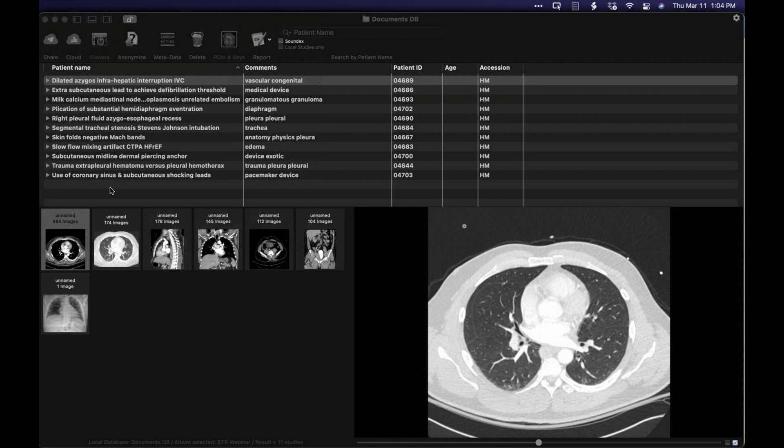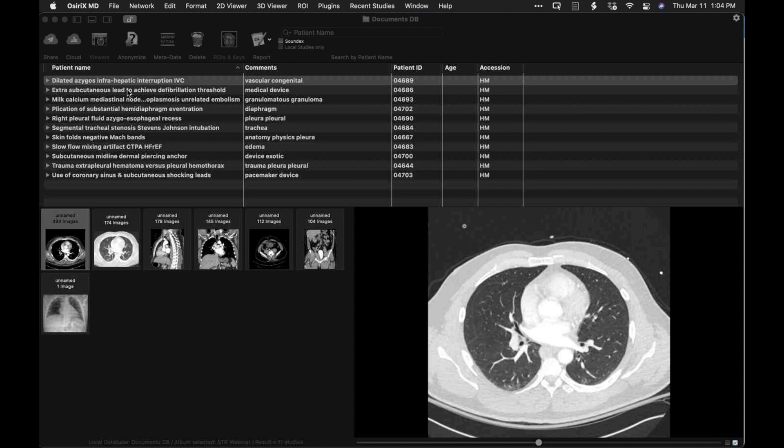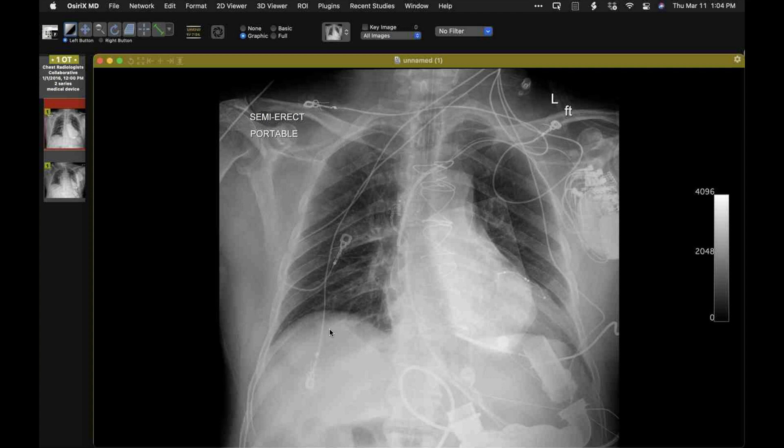First, just something we've seen before, but just in case other folks are not familiar with this, I'll show these two quick cases. Here is a patient with obviously an LVAD, and you can see that he has a CRTD pacemaker device in. So we have pacemaker leads in the right atrial appendix, right ventricle, and a coronary vein. At this time he's intubated and there's a defibrillator device.